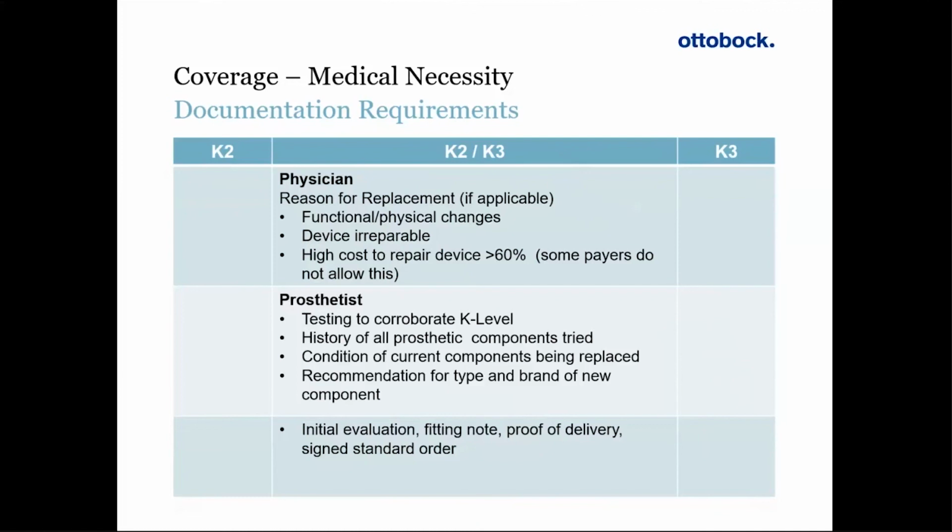So you'll want to be sure that your reason for replacement is in there, especially if you're replacing same or similar, going from one to the next. Why the current device meets their needs, and a lesser device would not be applicable. You'll want to be sure you document that, but also if it's a functional change or physical change in order to demonstrate that, especially if they're going from a K2 to a K3.